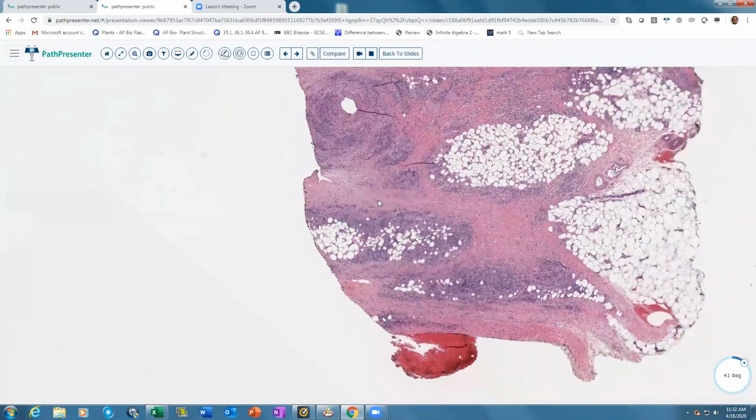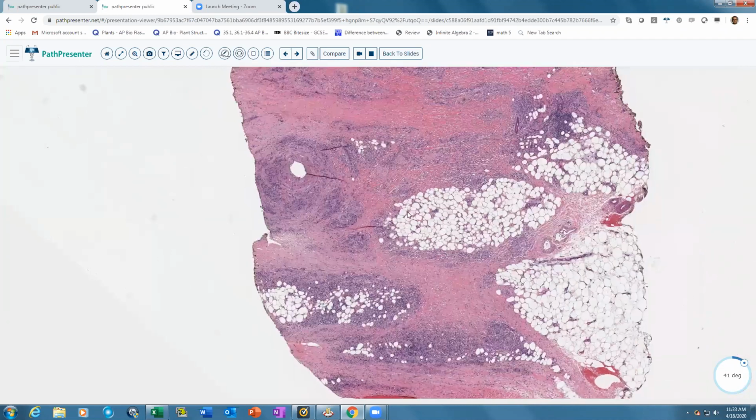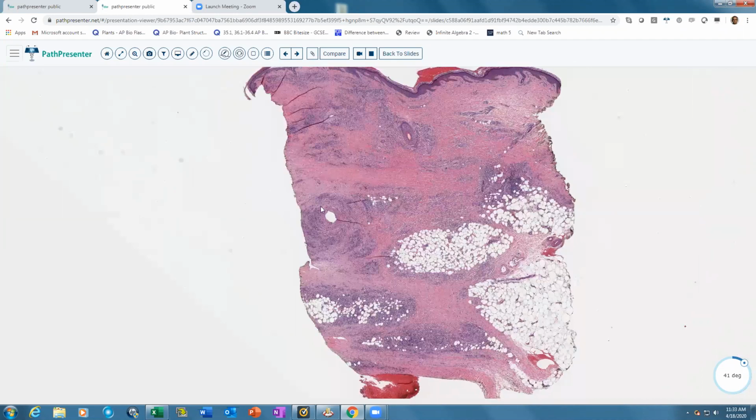If you do an EVG stain, there might be some loss of elastic fibers there actually. There's usually no vasculitis. So this cake layered pattern that you see here, of inflammation composed of lymphohistiocytic infiltrate plus some giant cells and plasma cells, associated with the sclerosis, which can even go into the subcutis, is very characteristic of necrobiosis lipoidica.